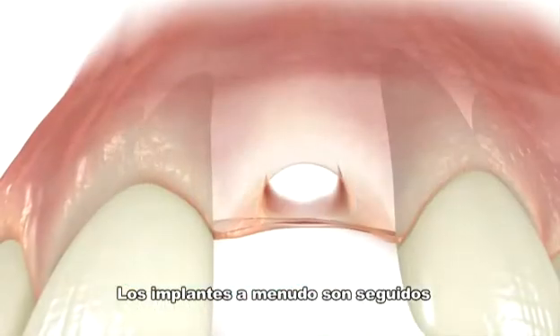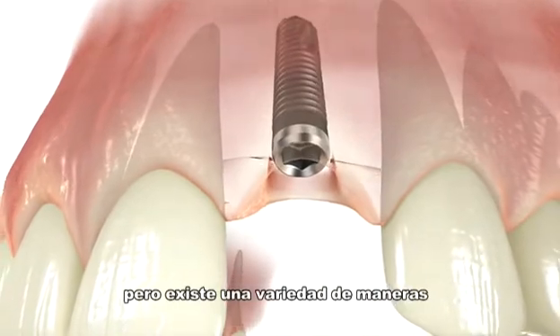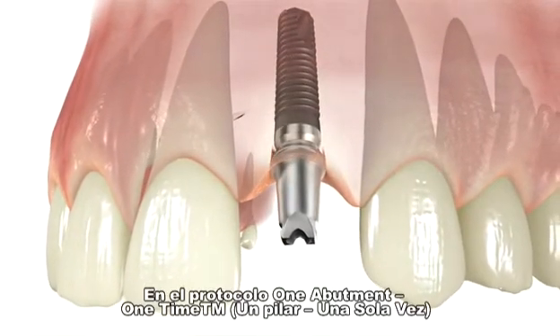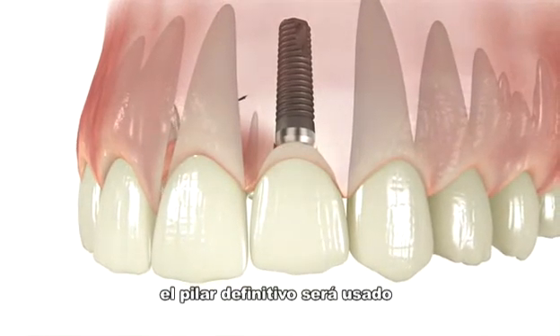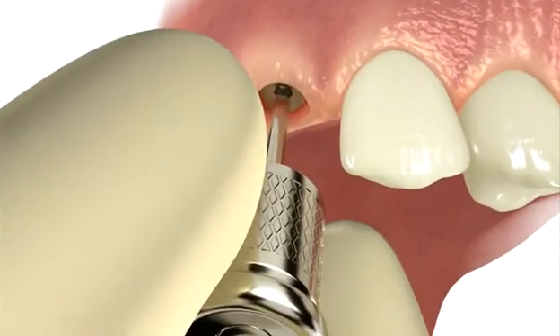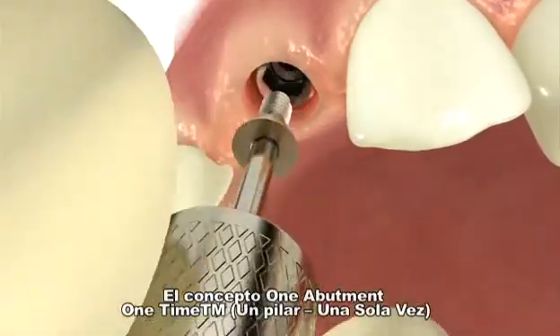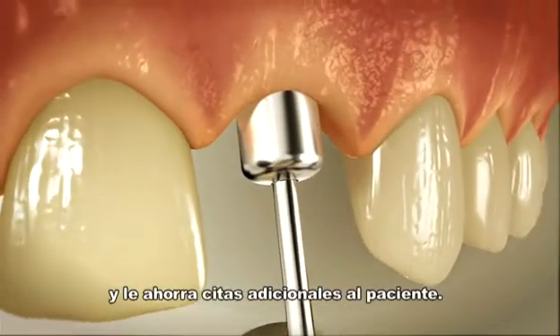Implant cases often follow a standard treatment plan, but there are a variety of ways to reach the final result. In the one abutment, one time protocol, the final abutment will be used to contour the tissue during the healing period, saving time and increasing aesthetics. The one abutment, one time concept eliminates the use of a healing collar and saves additional patient appointments.